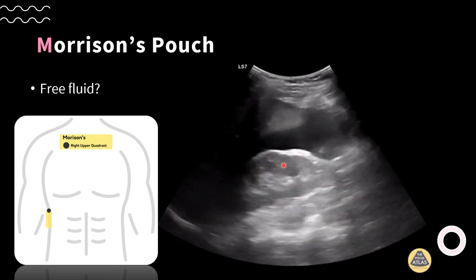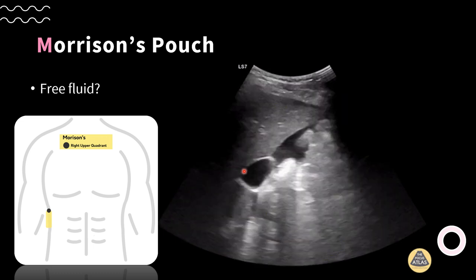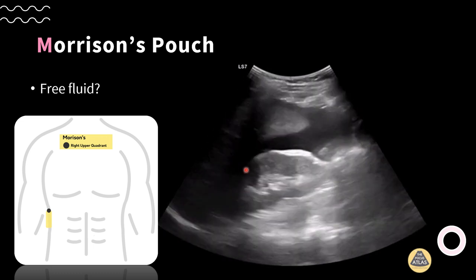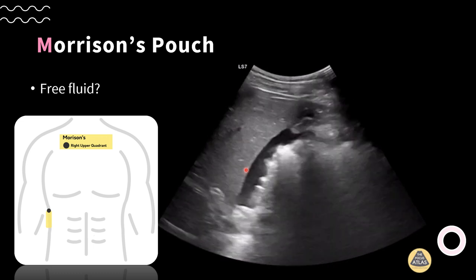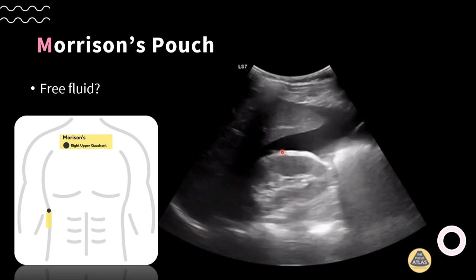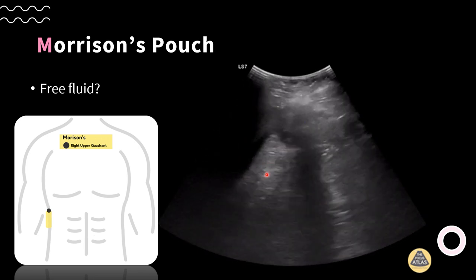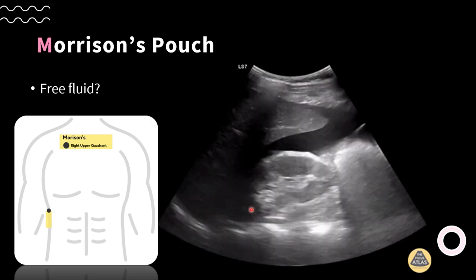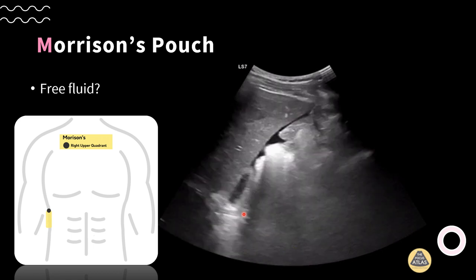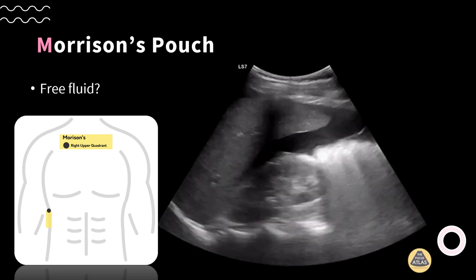And I'm often asked, why do you look at the abdomen for patients that don't have trauma? Well, you can have non-traumatic causes of free fluid in the abdomen, including ectopic pregnancy, ruptured AAA, ruptured hemorrhagic ovarian cyst, or more commonly, there's occult trauma, trauma that a patient was not able to tell you about that occurred yesterday or that a family member did not know about.